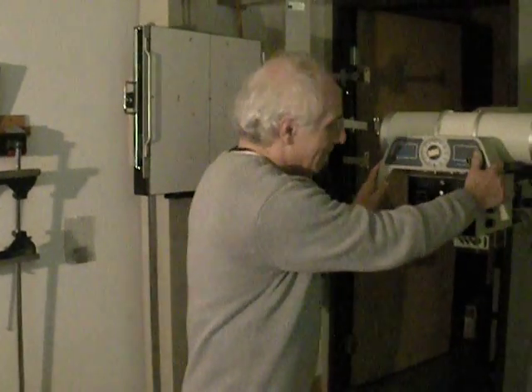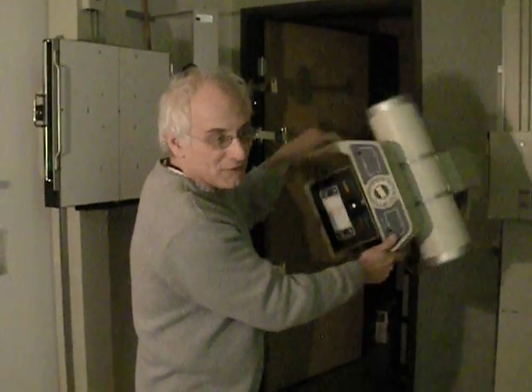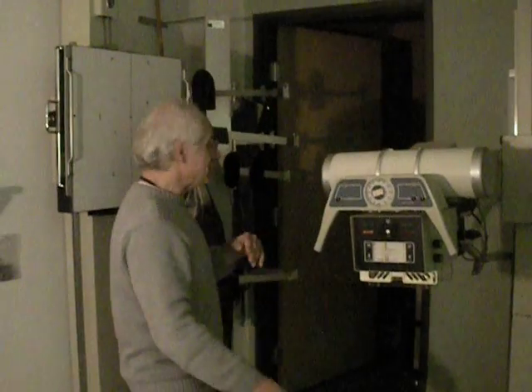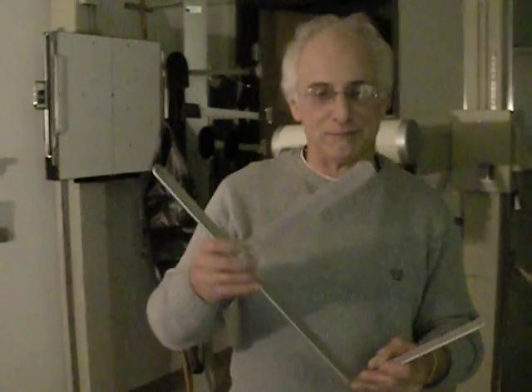All 3 of those things need to be centered to one another in order to make this work. And I encourage you to embrace the concept of setting up a field before you put your patient in here rather than put the patient before setting up. And we're going to measure the path of the central ray.